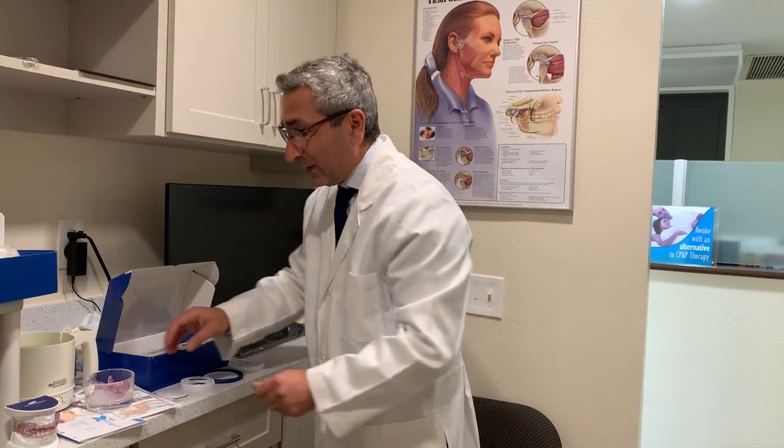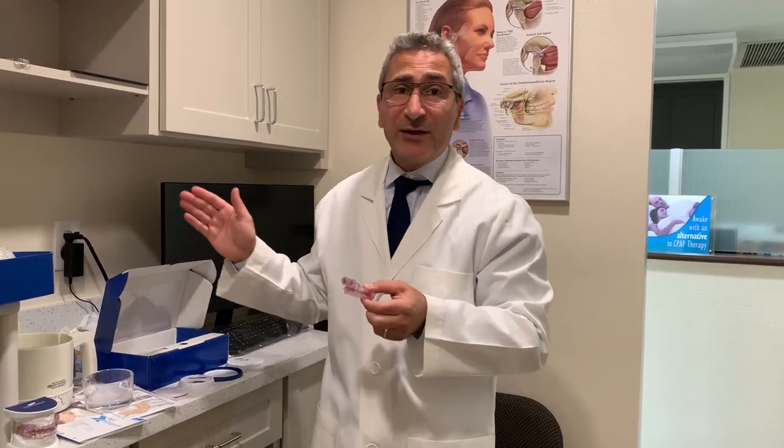For the first few days when you start putting in your mouthpiece, I want you to wear it an hour or two to get used to having something in your mouth. Then transition to wearing the mouthpiece 30 minutes to an hour before going to bed and try to sleep through the night with it. After one week of doing that, you just pop it in and go to sleep.